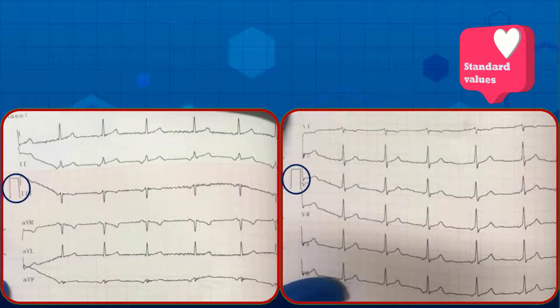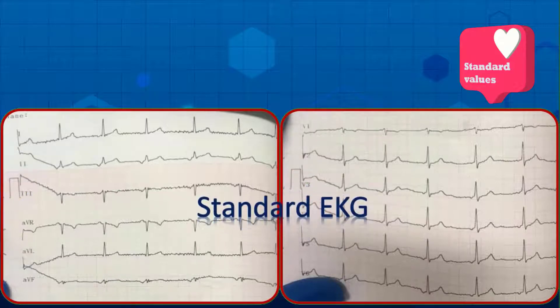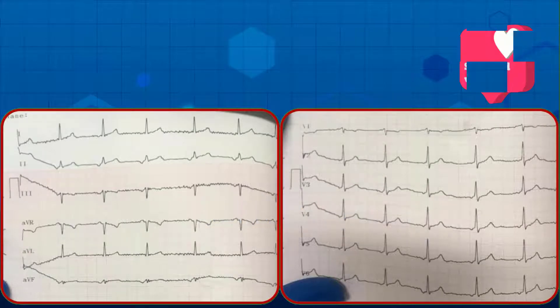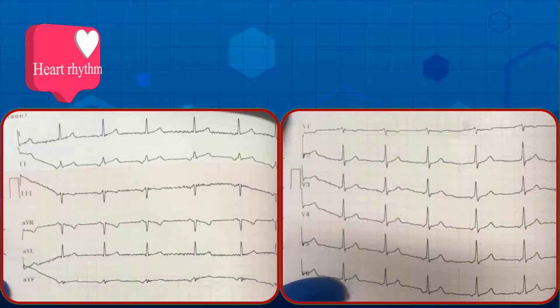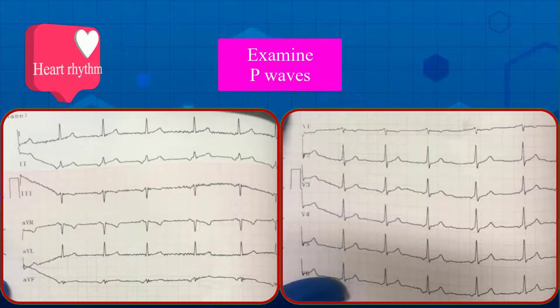First step: examine the standard values. As it is clear, the calibration marker is one large box wide and two large boxes tall; therefore this is a standard EKG. Second, determine the heart rhythm — as usual, examine three items to establish the underlying rhythm.